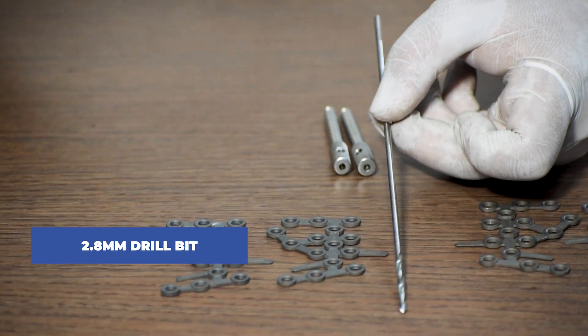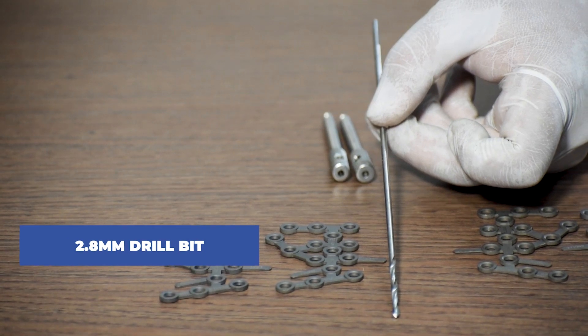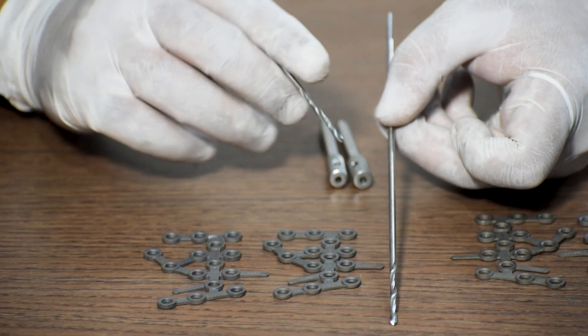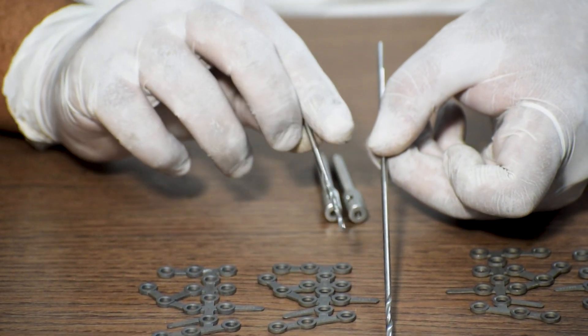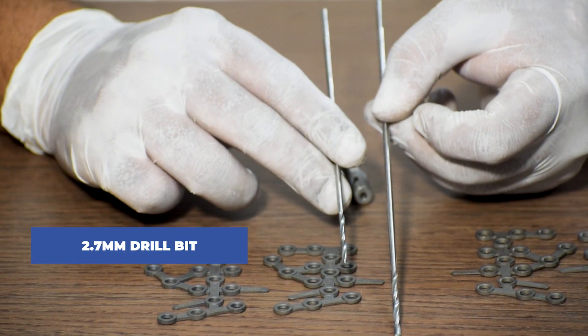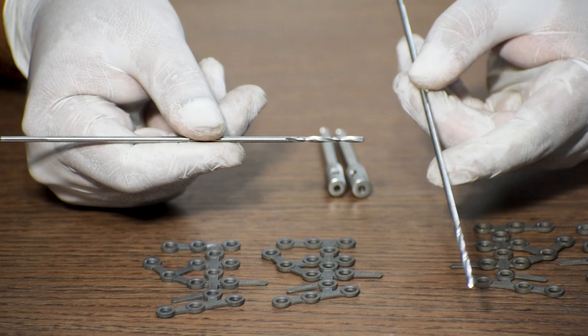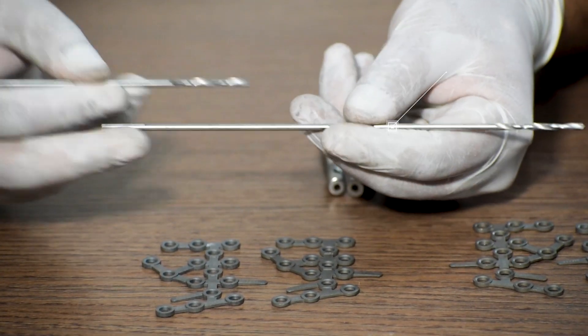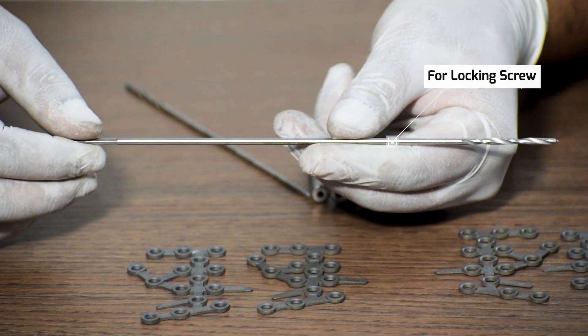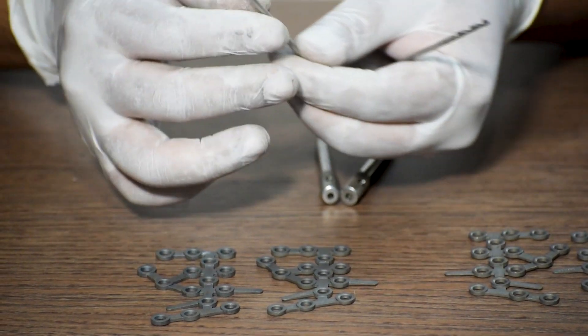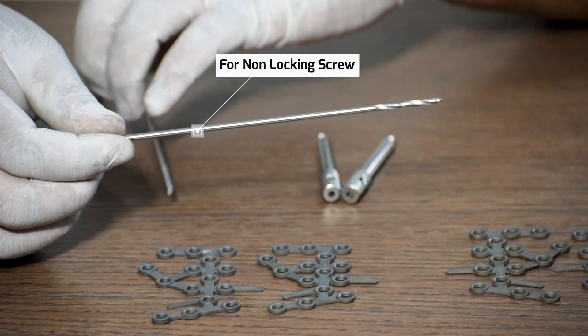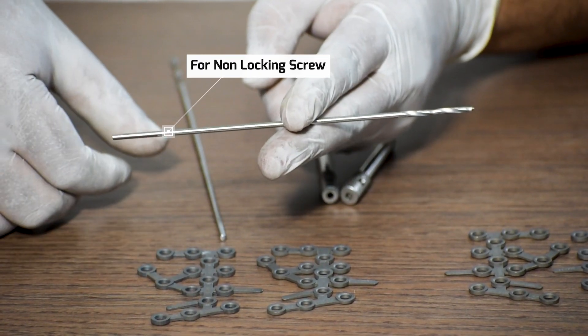Then for locking screw, 2.8 mm drill bit. And for non-locking 3.5 mm cortical screw and for 4 mm cancellous screws, 2.7 mm drill bit is required. Remember 2.8 mm drill bit for locking screws and 2.7 mm drill bit for non-locking screws.